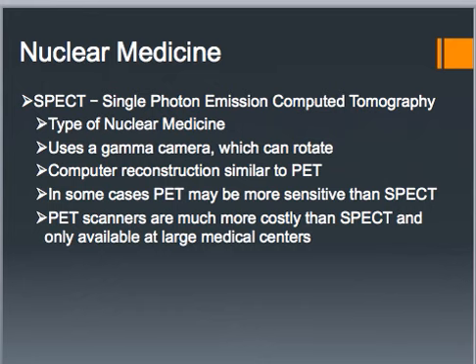But a lot of times if they don't have them on site, they'll haul them in a semi-trailer, like once a month or once every couple weeks or once a week, and they'll set up the semi there and bring patients right out to the semi-trailer and scan them there. So that trailer moves around to a bunch of different locations at different hospitals for people to get PET scans in an area where it wouldn't otherwise be available.